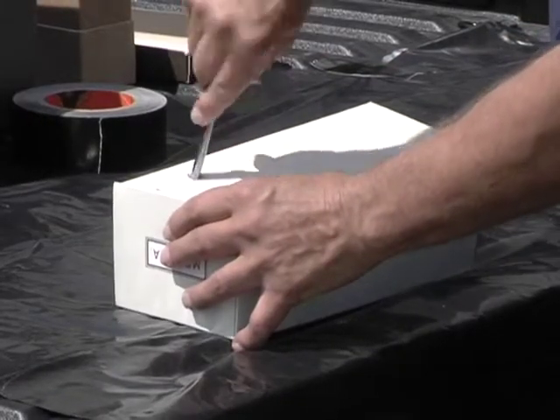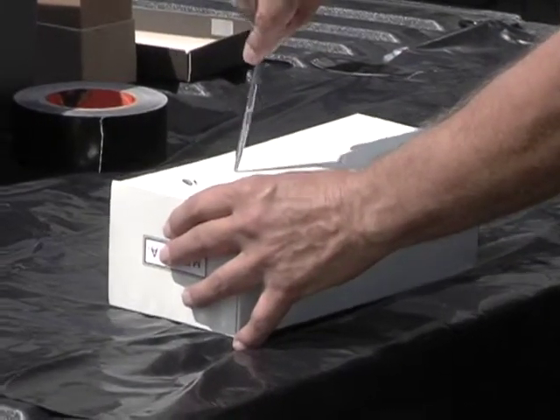Next, create a holder for the BHI broth tubes and Dacron swabs. A small cardboard box, such as a shoe box, works well for this.